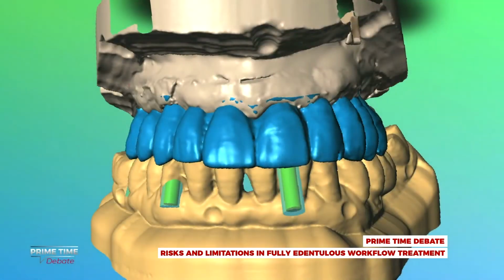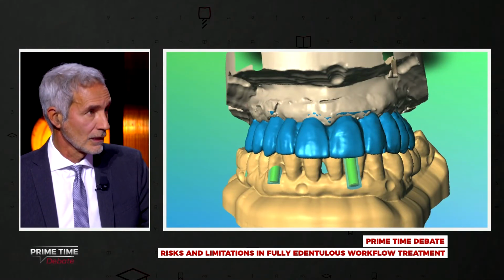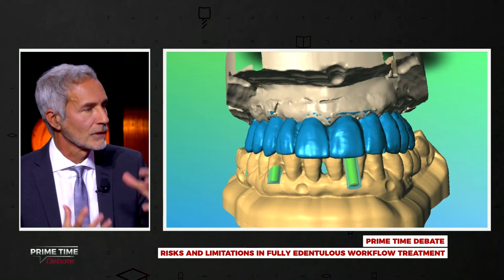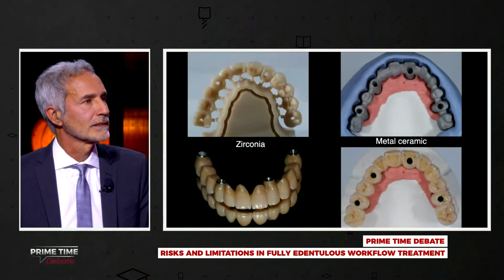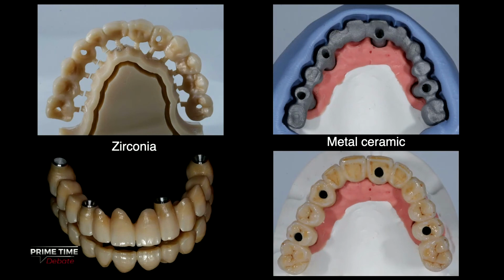This is what the dental technician did by placing the impression taken in the patient's mouth matching with the setup, the provisional, that is the same thing. In this way, you have all the data on the virtual articulator. It can go on. We could discuss maybe half an hour more on the material, but we are lucky we have not the time to do this. Of the platform, we can go on for as long as we want.